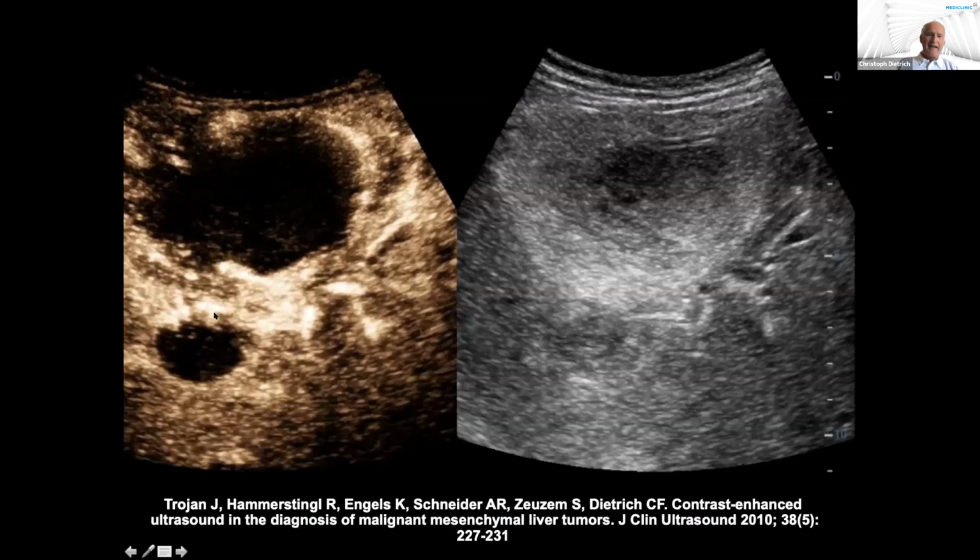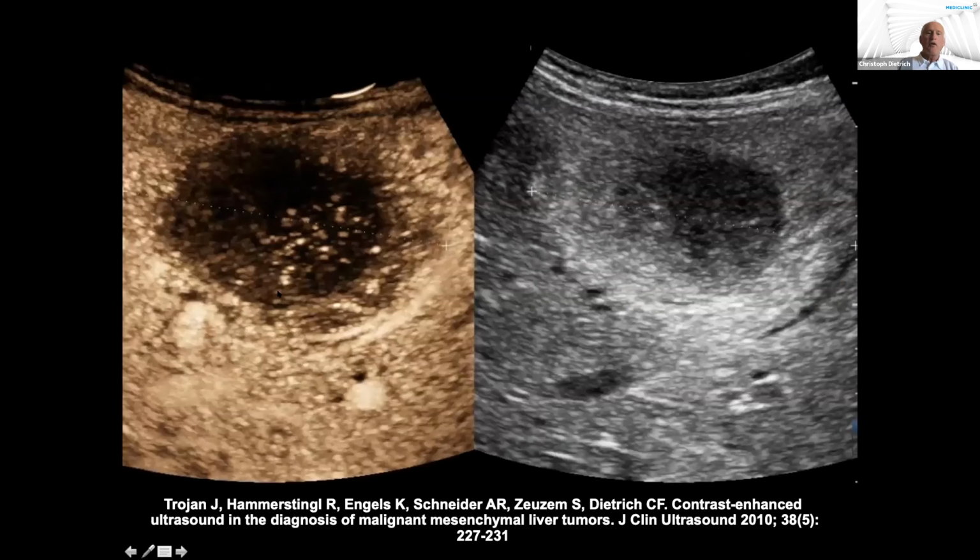Caveat, there are lesions looking like peripheral nodular contrast enhancement, like here, but it shows wash out. It is a hemangioendothelioma. So in the portal venous phase, the lie detector tells us there's a need for biopsy and histological examination. There are pitfalls, for sure.